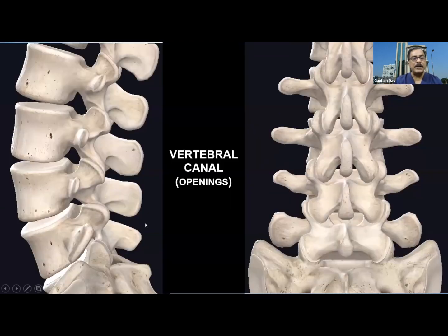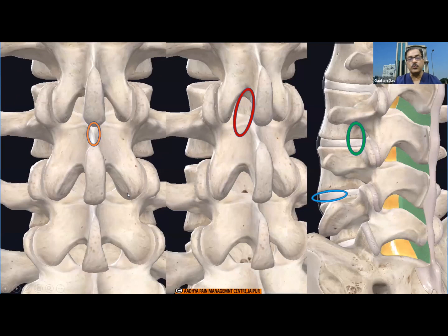If you are looking from the lateral view, then the vertebral body, the transverse process, you can see it's small. This whole is your superior articular process. This projection is your mammillary process. When we'll be scanning from lateral to medial, the first elevated part we'll be able to see will be your mammillary process. And this projection is your accessory process. And the other parts, as I told you, you all know that.